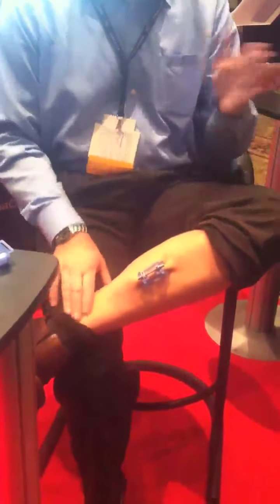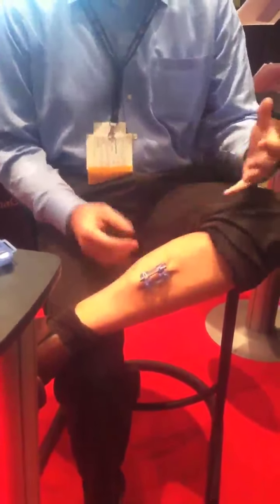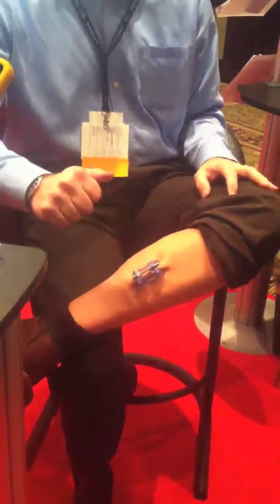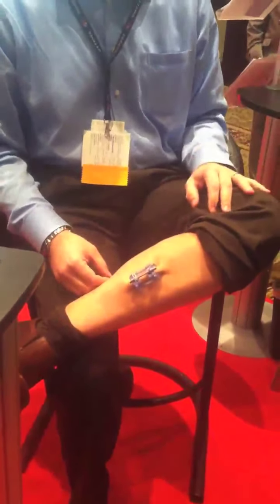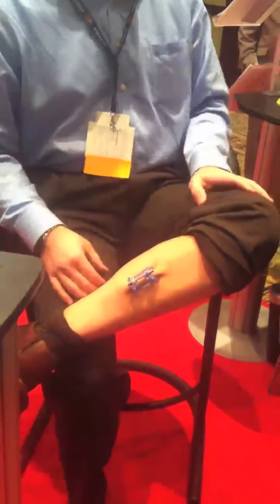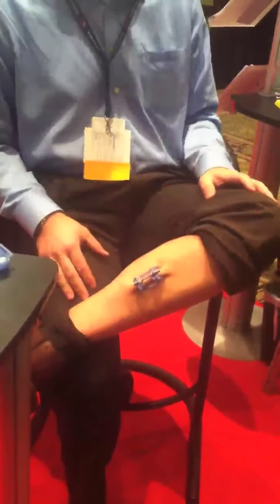I would put this truly on about a one, maybe one and a half at most in terms of insertion pain. I'm in place — all I can do is feel it. I know it's there. It's a little more than a binder clip because I can feel it's really grabbed on, but it's not like I'm in agony. If you were also starting 14-gauge IVs on me, putting me on oxygen, throwing me on a backboard, and cutting my clothes off like a real trauma patient, I'd probably forget this is even happening.